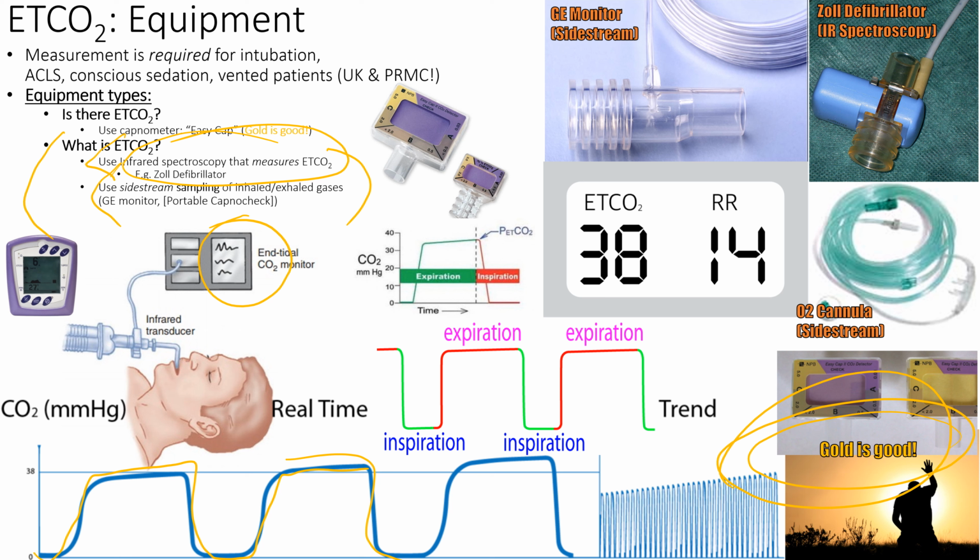After class, we can go and show you on the Zoll how to set that up. Every code needs to have that set up because it's important in codes to measure end-tidal CO2. It measures how good your CPR is, and it measures if you have ROSC. It has a lot of good information. Every Zoll defibrillator has it.